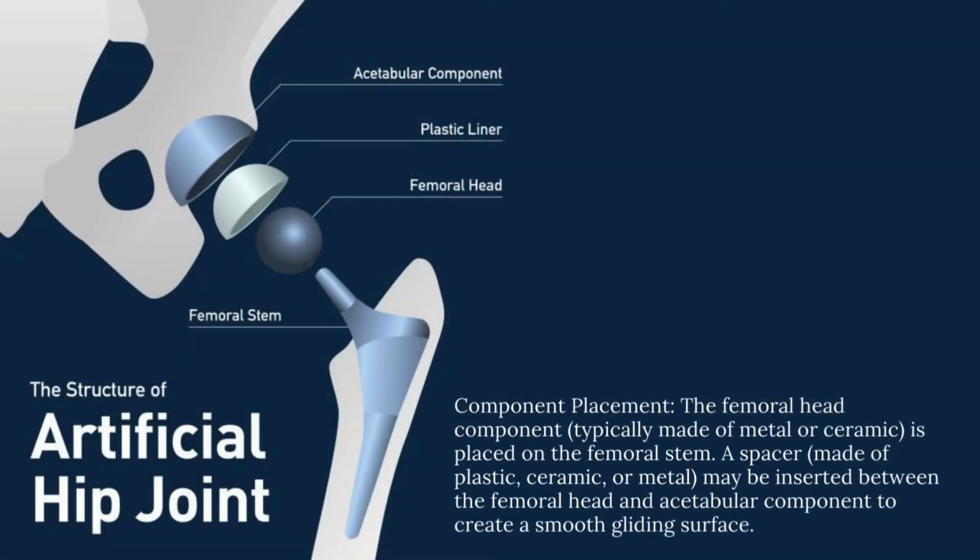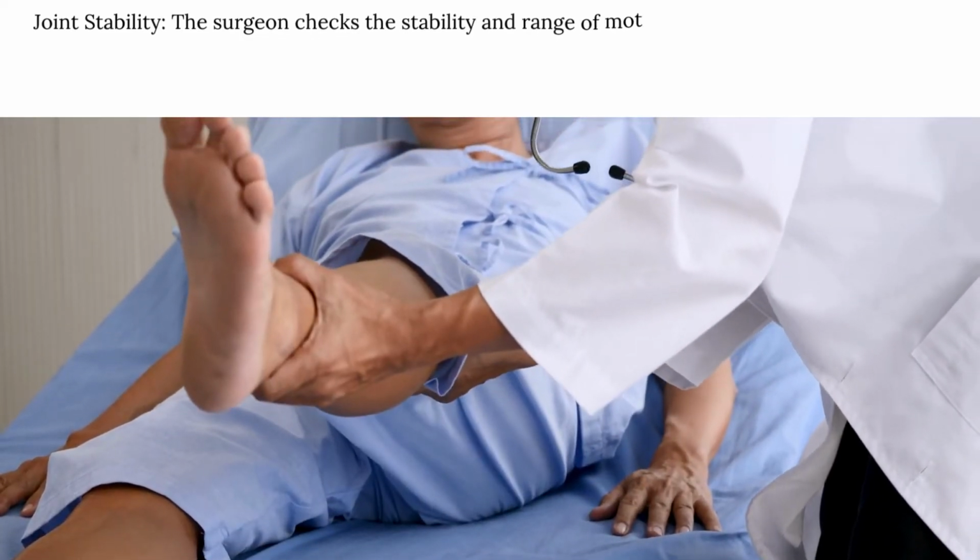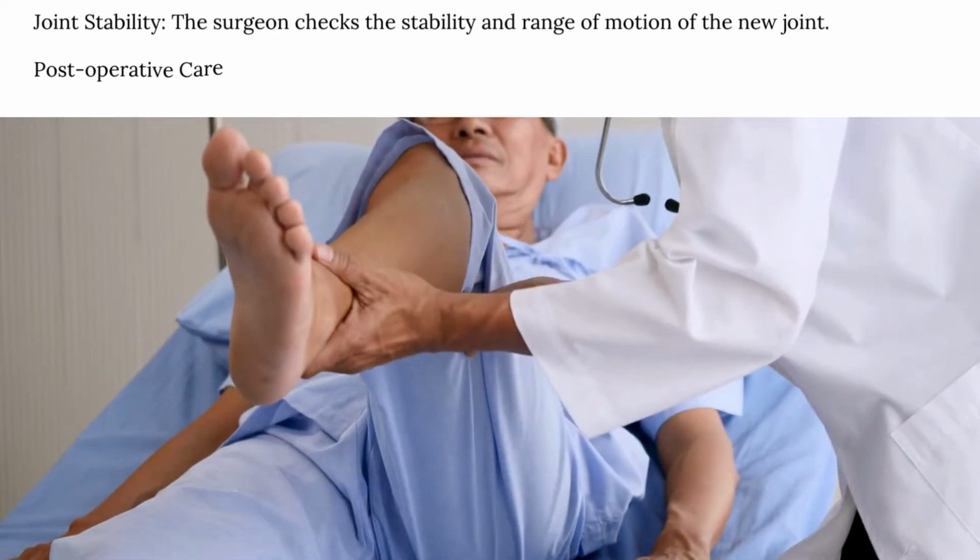Component placement. The femoral head component, typically made of metal or ceramic, is placed on the femoral stem. A spacer made of plastic, ceramic, or metal may be inserted between the femoral head and acetabular component to create a smooth gliding surface. Joint stability. The surgeon checks the stability and range of motion of the new joint.